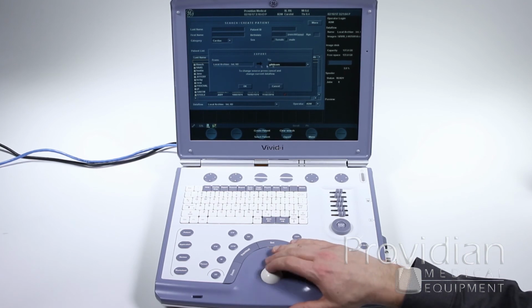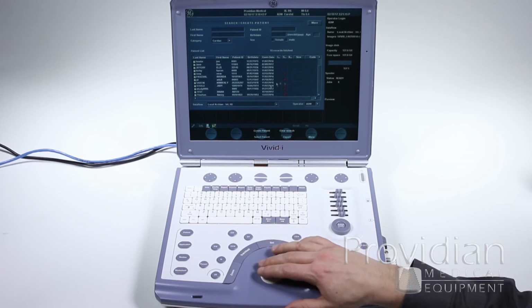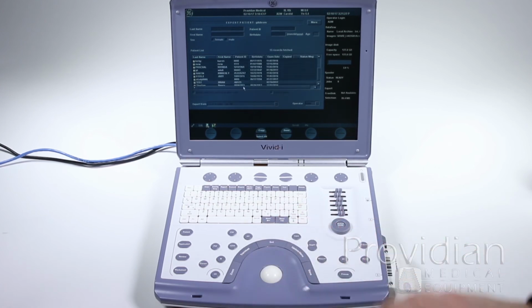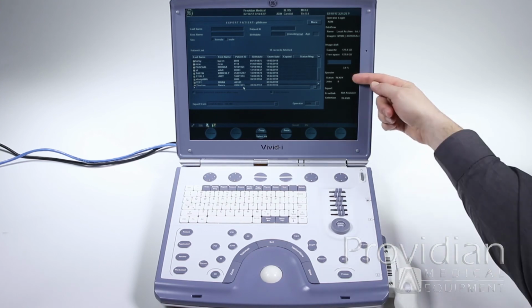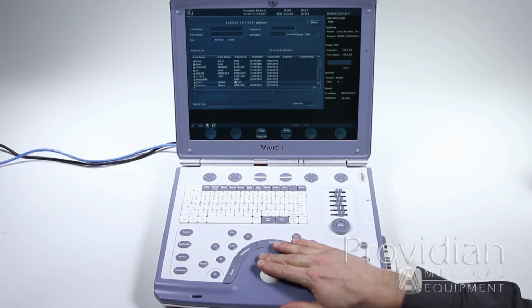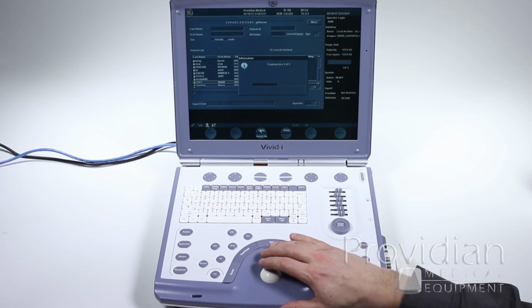So it says export local archive to the DICOM server I'd set up. And I'm going to go ahead and click OK. But before I do that, I want to hit cancel. What makes this so difficult is that you think that if you click here and highlight one, and click export, and then I chose local archive and click OK, and nothing happens. It says my spooler, the status is ready, job 0. And we're just waiting there, and nothing is going on. It's totally confusing, because what you still have to do is make sure that the patient is selected, and then click copy.